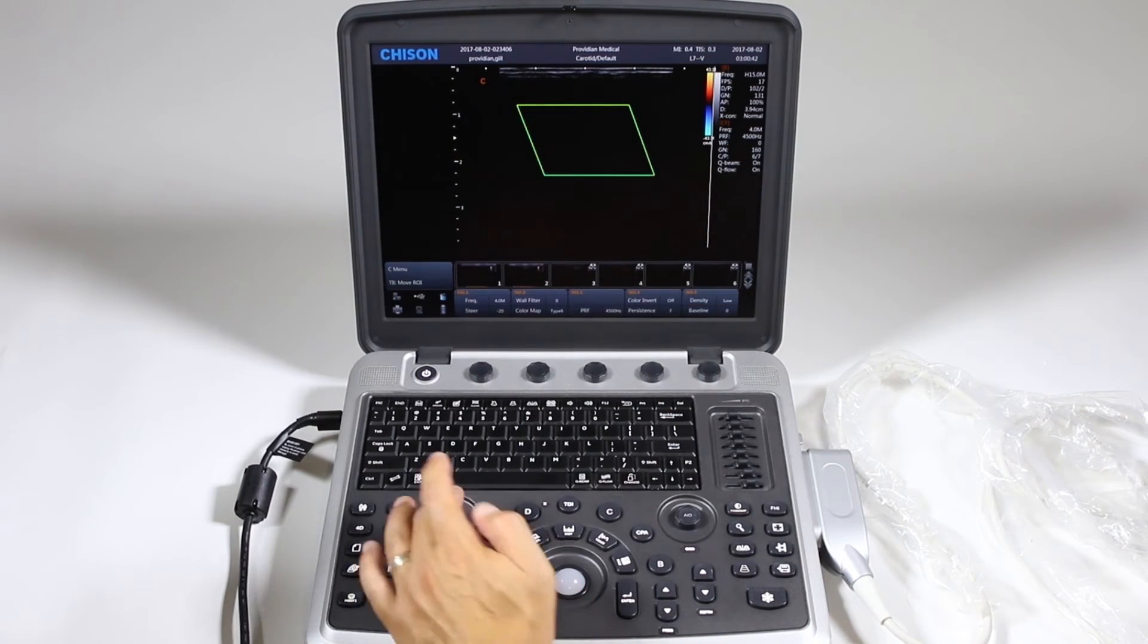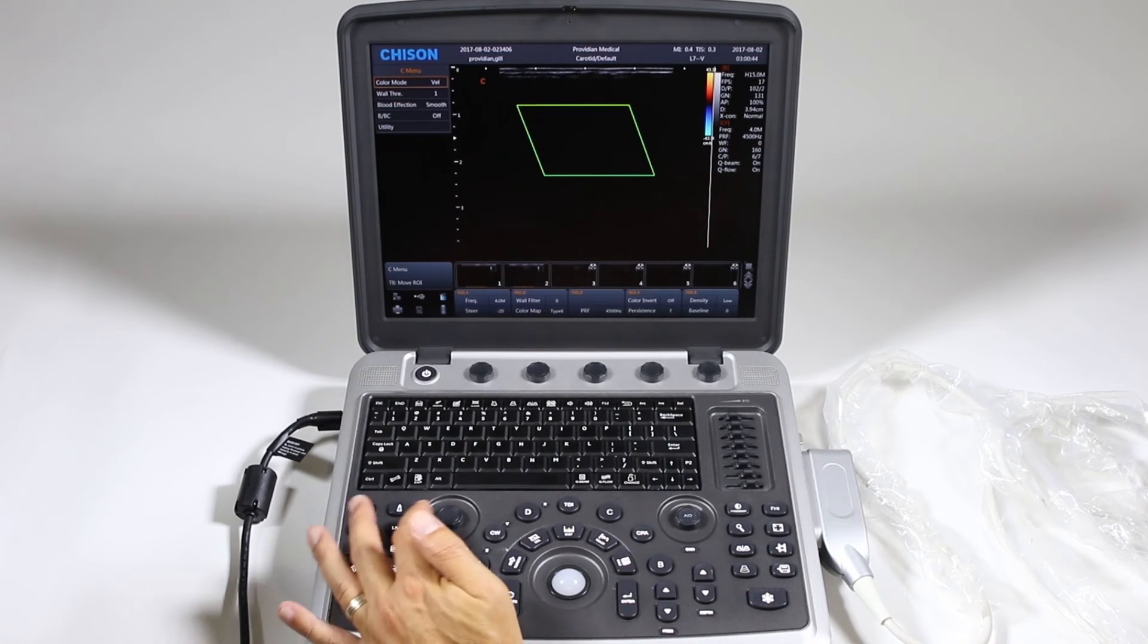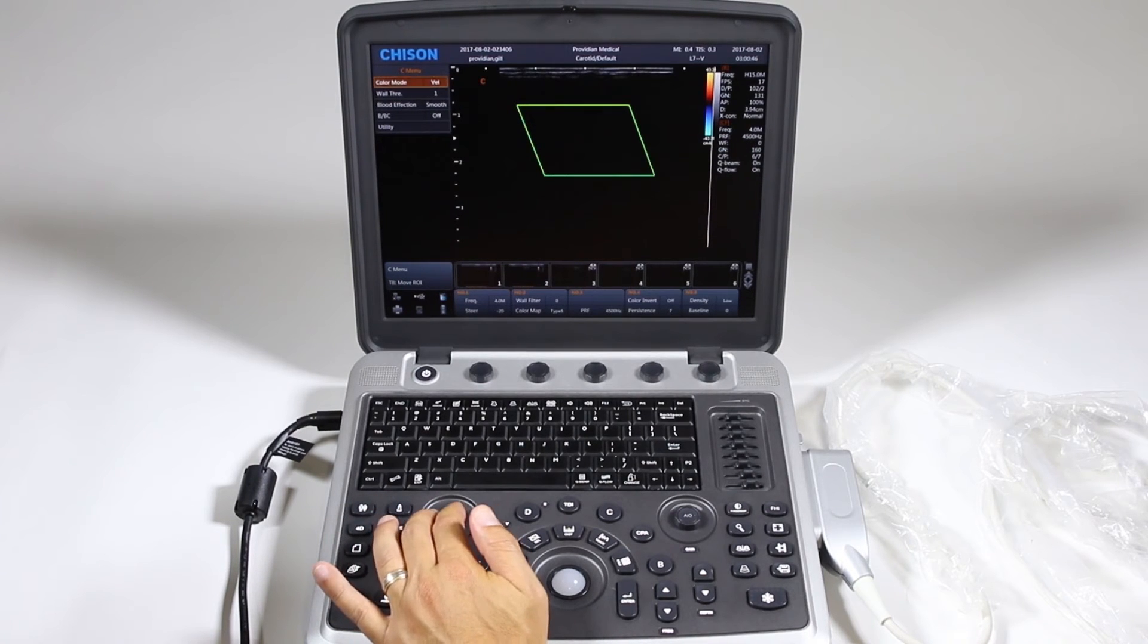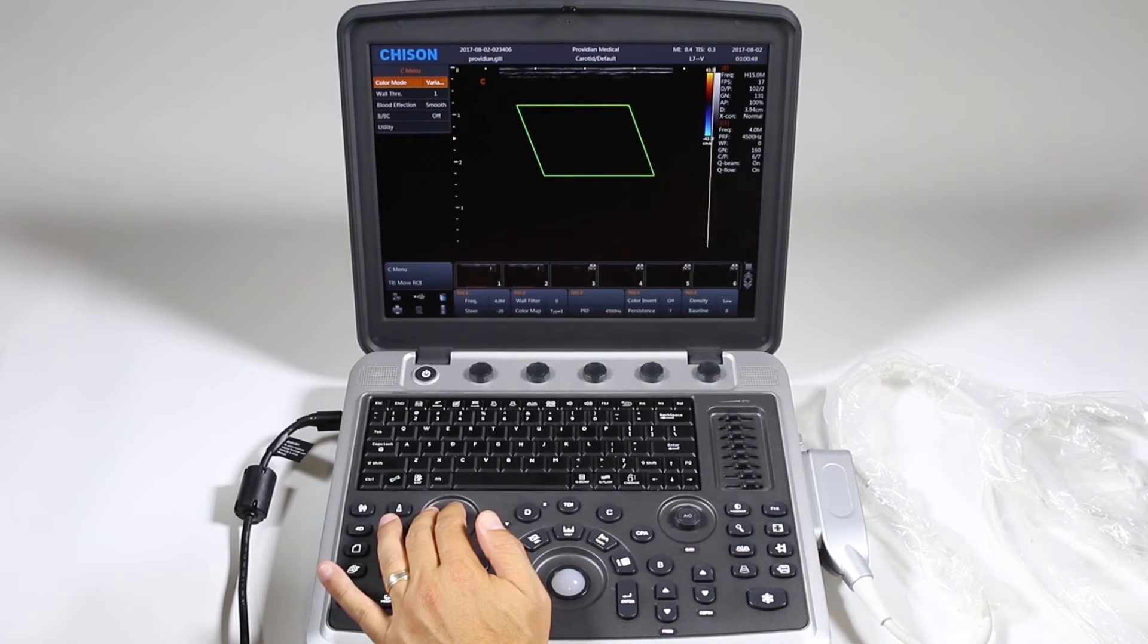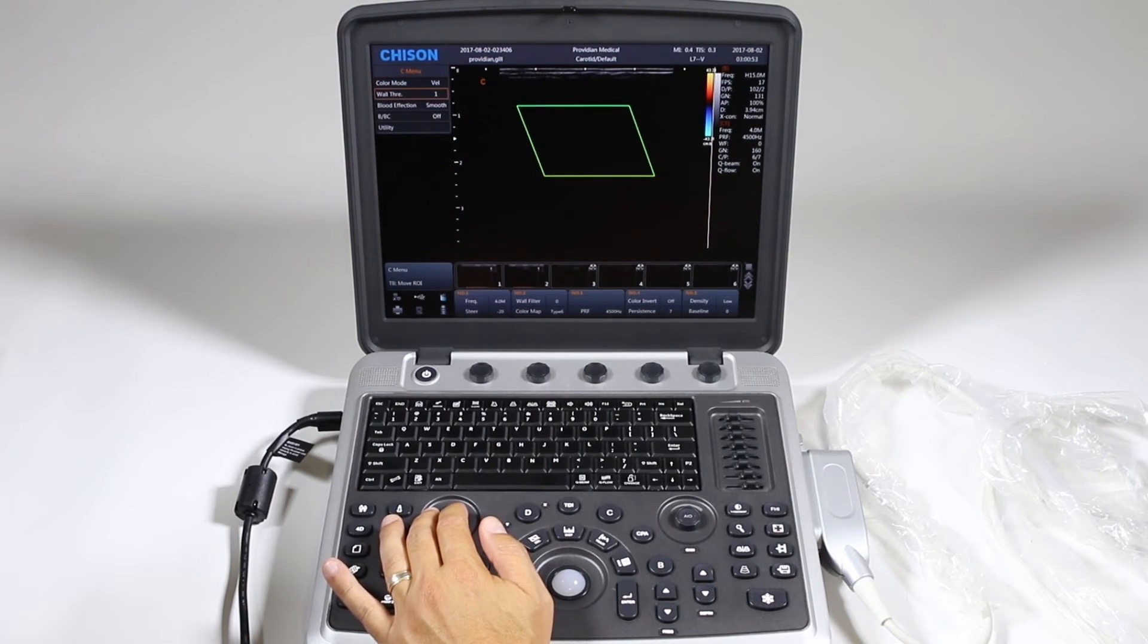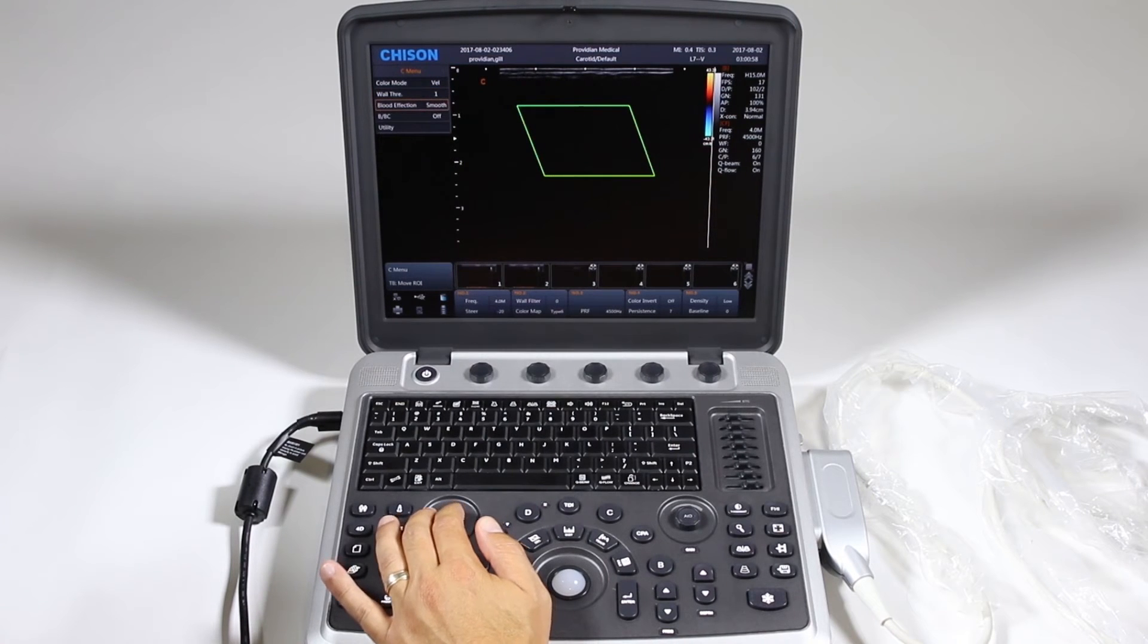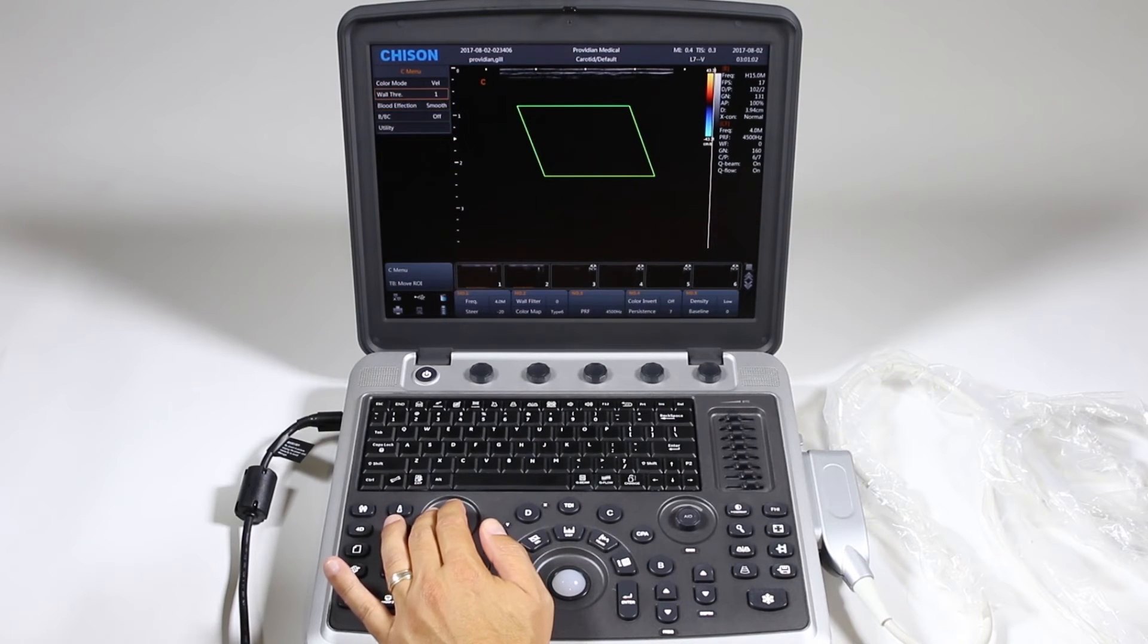You also have a sub menu here, just by pushing down to get to the menu. You have two different color modes: variance and velocity. You can change your wall threshold here, which will improve high or low velocity. Blood affection is just basically, do you want really high resolution or smooth.